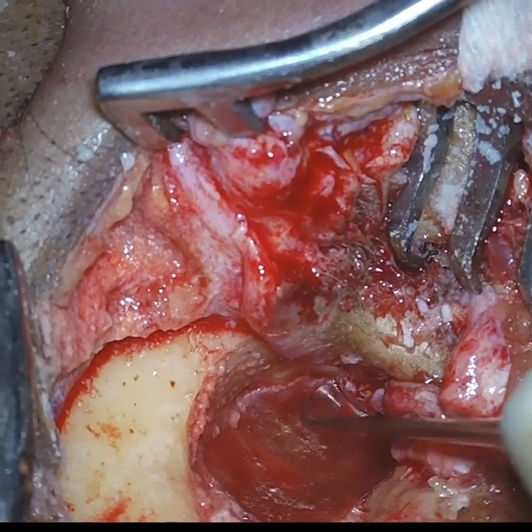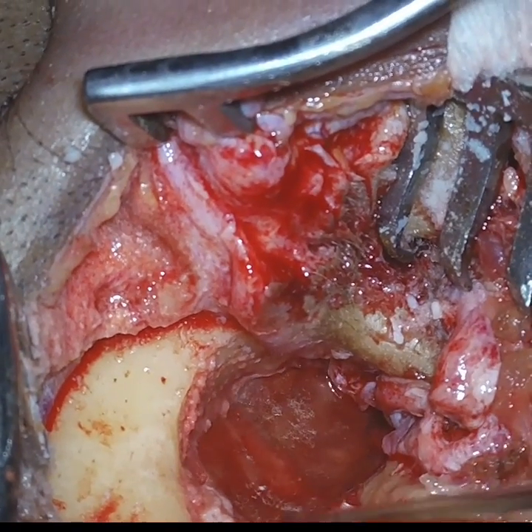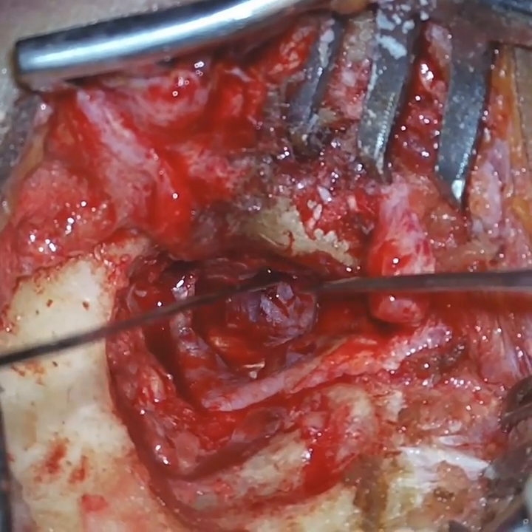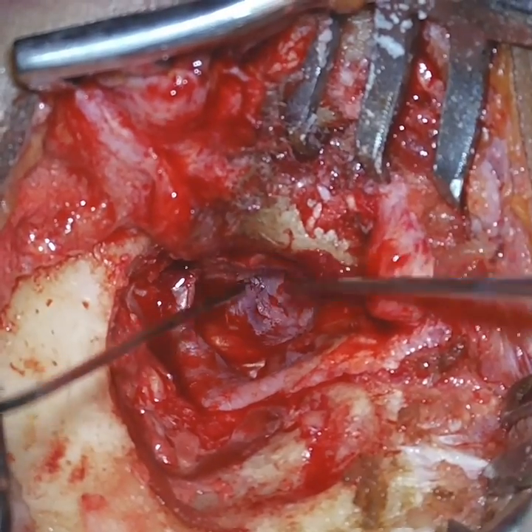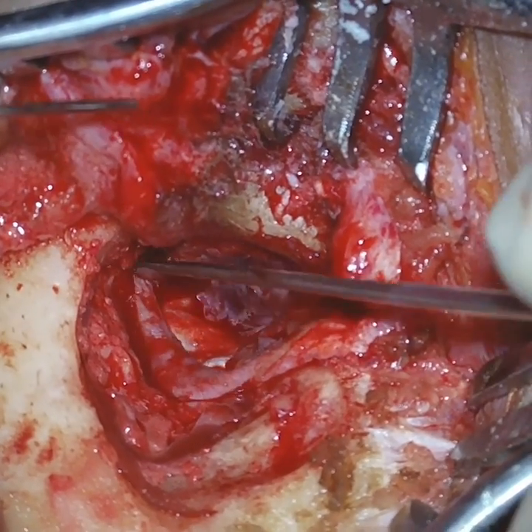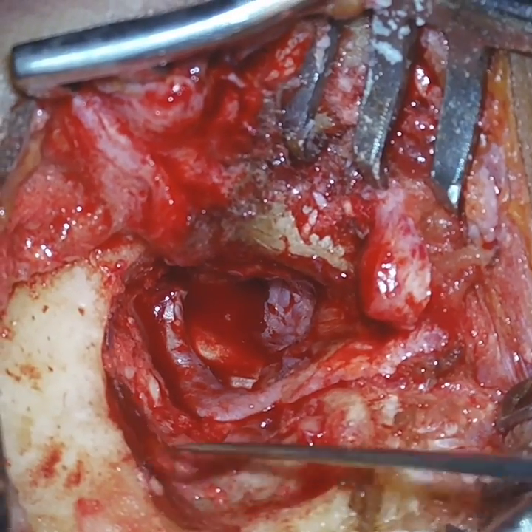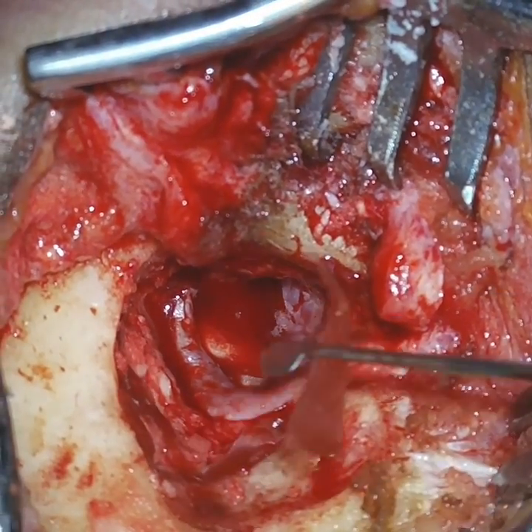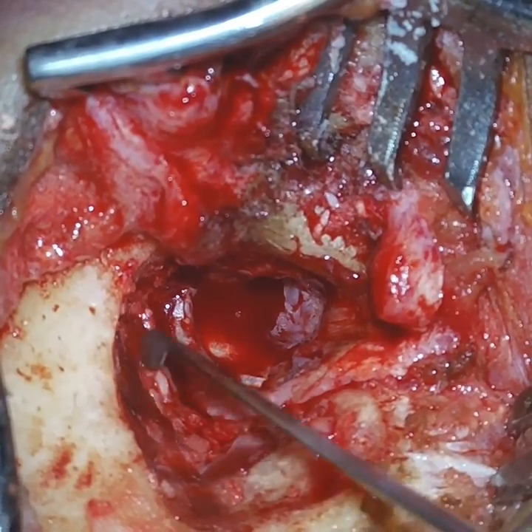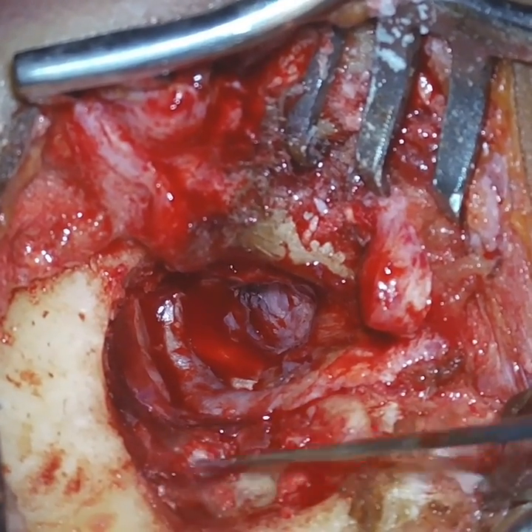The remnant skin is very important, and the remnant tympanic membrane is very important, so it gives very good and very quick healing, and no part of the exposed bone should be left exposed. So try to cover as much of the exposed bone as possible. Here we are using small pieces of temporalis fascia which we harvested from the big graft, and then the required graft we have used, and the remaining area we have just covered with remnants of cartilage and then bone paté.